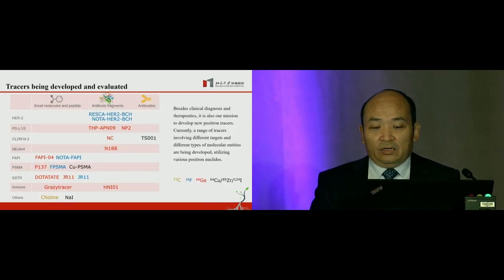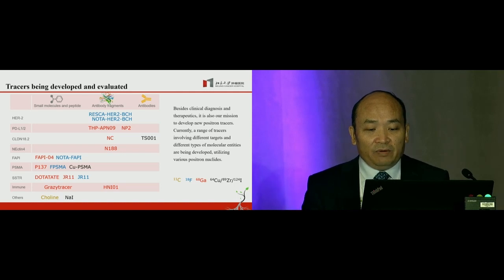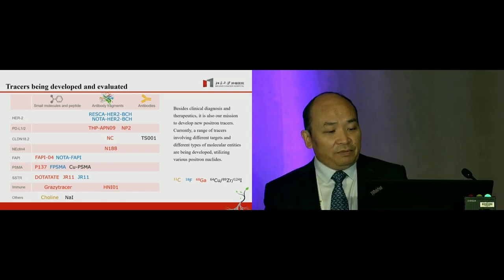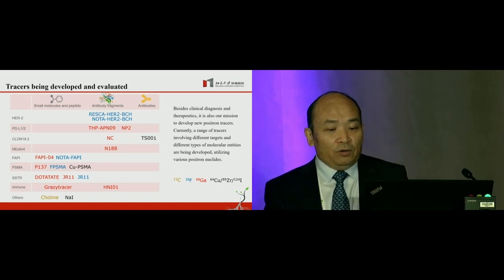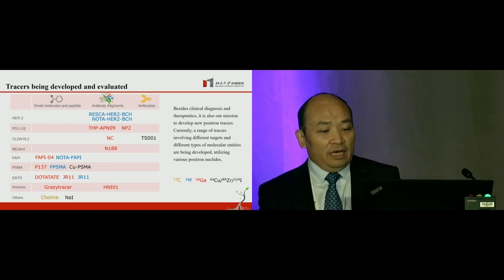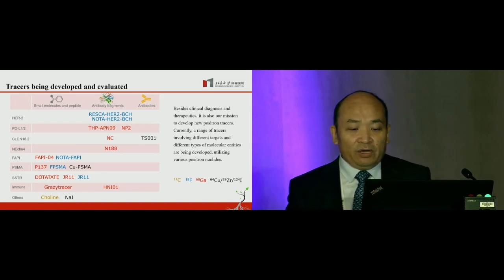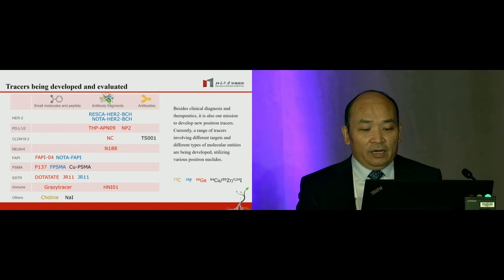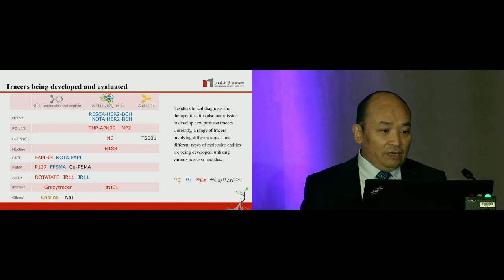Besides the clinical routine for uEXPLORER PET-CT, we have also conducted clinical trials of an array of new tracers. These tracers range from small molecules, peptide, antibody, nanobody, and monoclonal antibody. They cover a broad spectrum of targets, including HER2, PD-L1, PD-L2, Claudin 18.2, Nectin-4, et al. Various positron nuclides such as carbon-11, F18, copper-64, gallium-68, zirconium-89, and iodine-124.